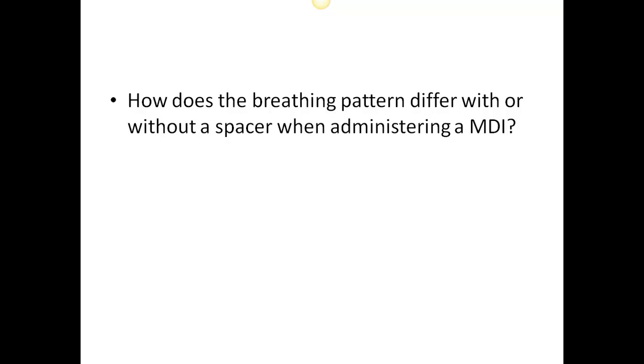How does a breathing pattern differ with or without a spacer when administering an MDI? Think about that for a minute. And remember, with a spacer, we're going to activate the chamber and then take a slow, deep breath in with a breath hold.